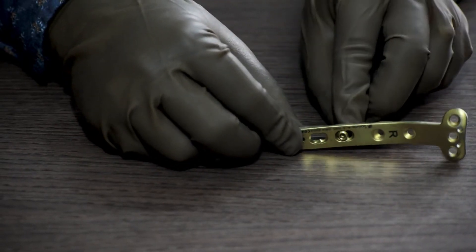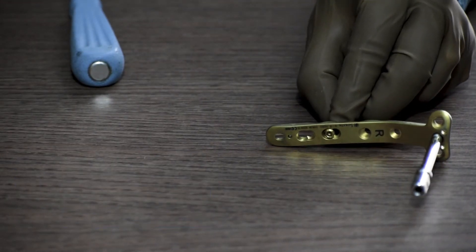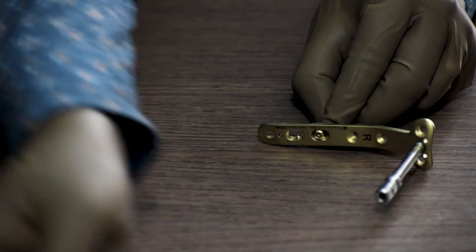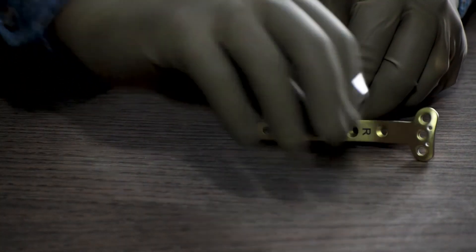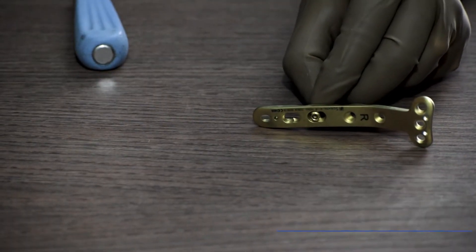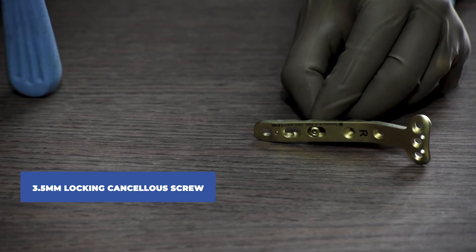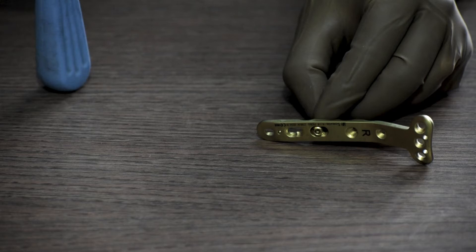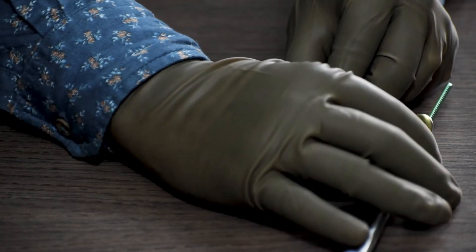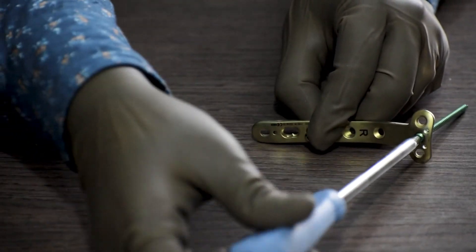Next, we fix the proximal end of the plate using a 3.5mm locking sleeve placed in the locking hole of the proximal part of the plate. We then use a 2.8mm drill bit to drill through the locking sleeve. After drilling, we remove the locking sleeve and use a depth gauge to measure the required screw length. We take a 3.5mm locking cancellous screw and, with a 3.5mm solid screwdriver, lock the screw in the bone on the plate. The proximal end of the tibia is cancellous, which is why we use a locking cancellous screw here.